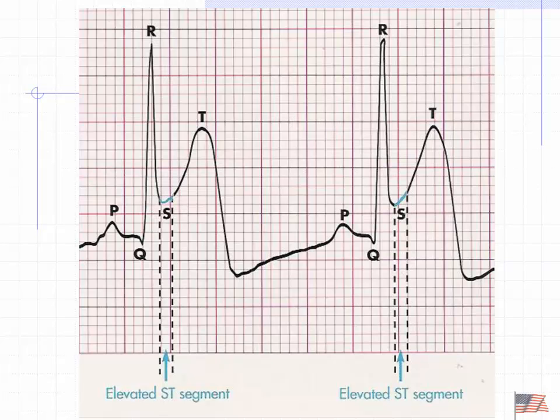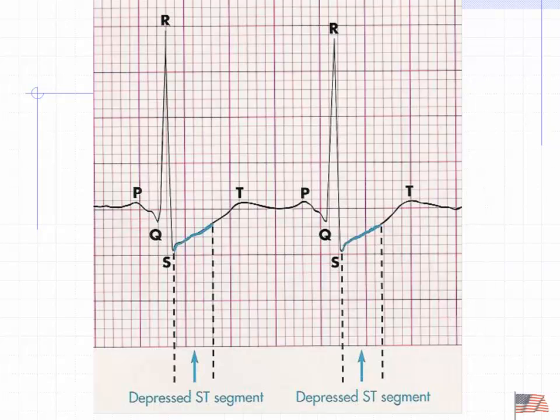So there is some clear ST elevation. Here's my baseline. There's my ST segment. Signs of injury going on. ST depression. Here's my baseline. There's my ST segment. Signs of ischemia.